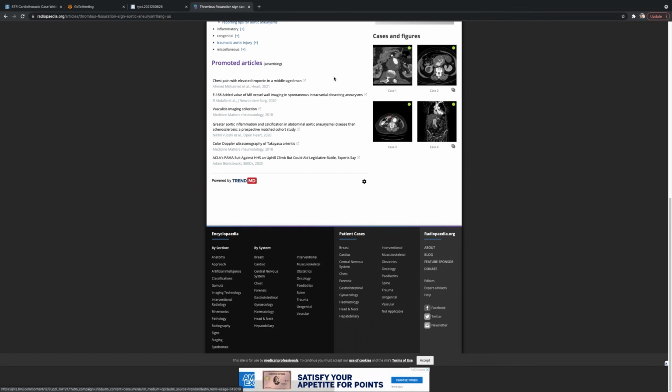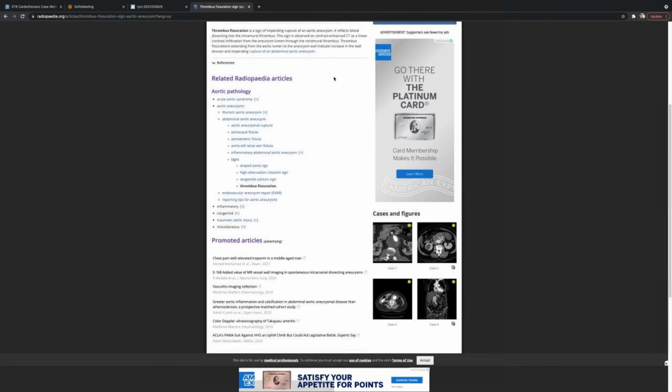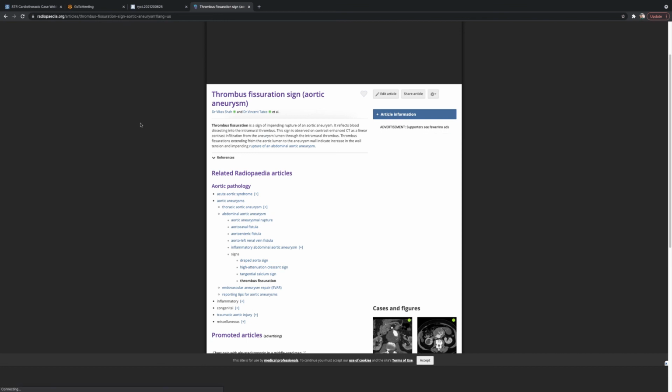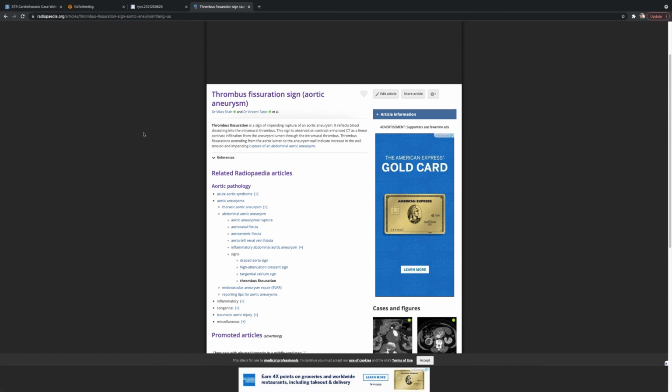It makes sense. I just never really. This was published somewhere. Thrombus fissure, impending rupture. Makes a lot of sense. Yeah. That initial one that you showed, I think, was a contained rupture, basically. Yeah, and the MR showed the adventitia out there, but clearly it was not a lung mass invading. Even on the CT, I think it was pretty convincing. But it was nice being able to get the old imaging within less than half an hour.